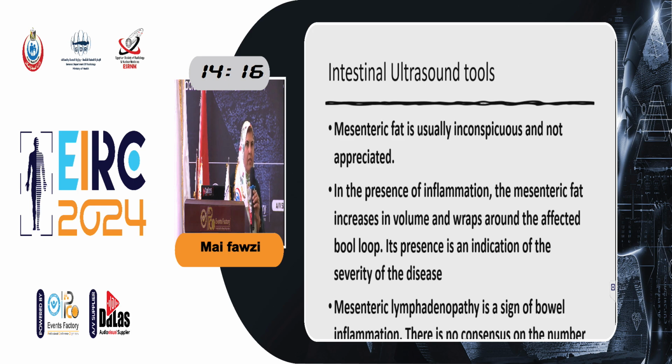You can also see that one of the important points in assessment of the bowel is the presence of creeping fat. Creeping fat is a nomenclature from CT, and since you're all radiologists, I know you understand that. The expansion of the mesenteric fat to cover the inflamed bowel. By ultrasound, I can also detect creeping fat, and I can understand that this part is markedly inflamed. It's not a good sign.